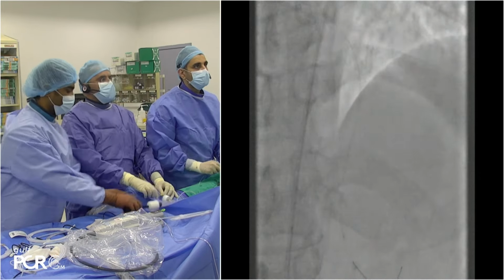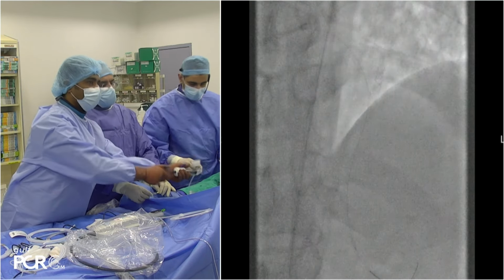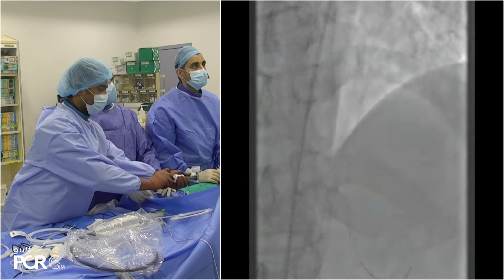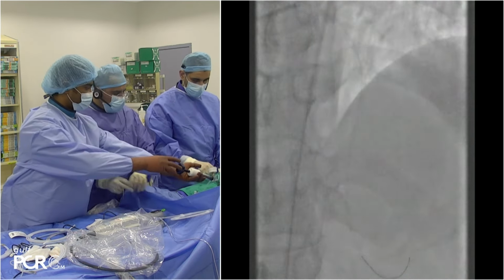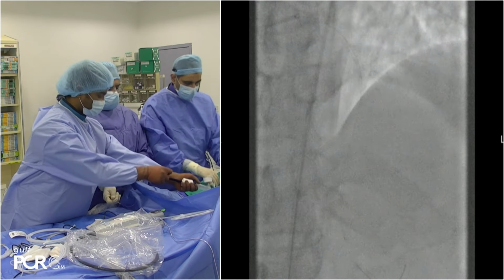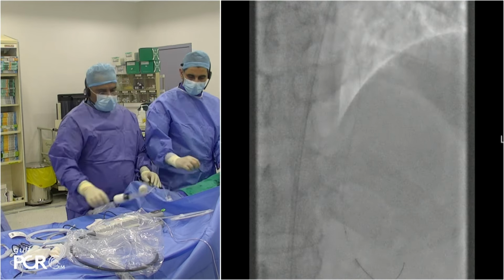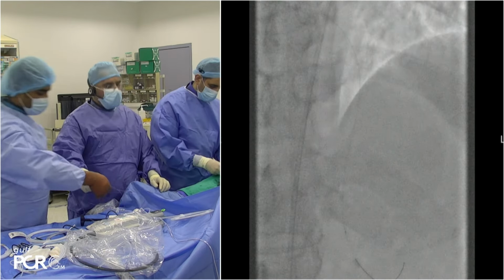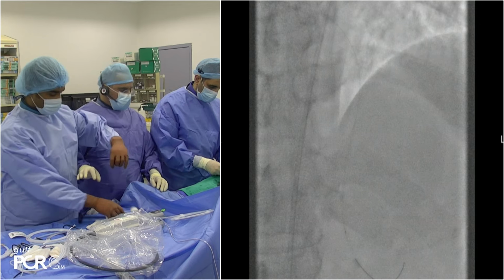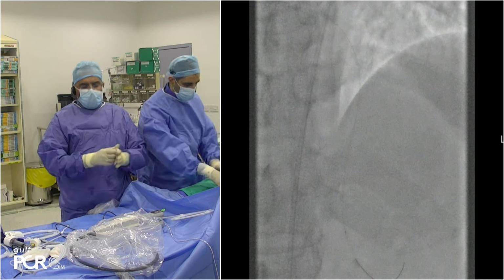Yeah. Go ahead. What, Ibrahim? I mean, since you had OCT imaging available, you would wonder about using it after the orbital to see if you had modified your nodule effectively or not. That's the plan, Ibrahim. That's the plan.